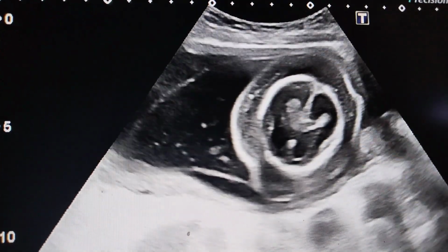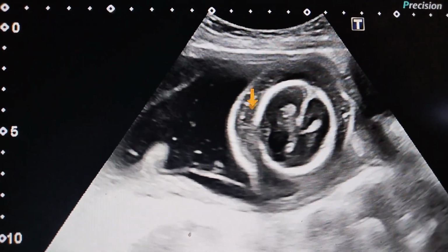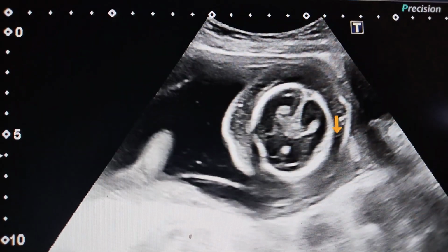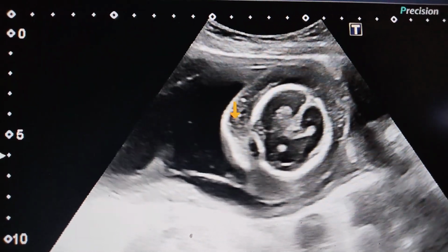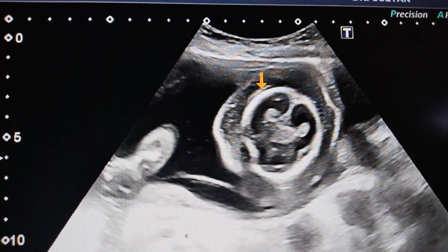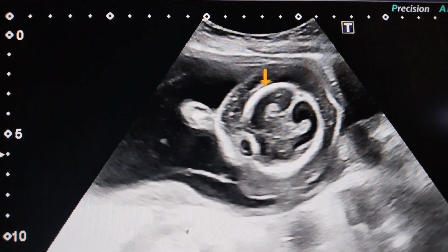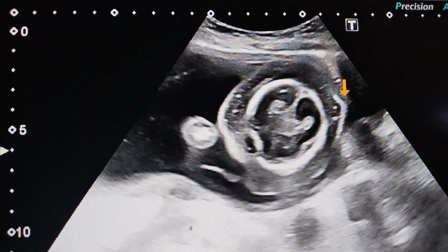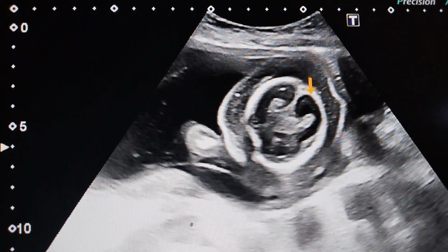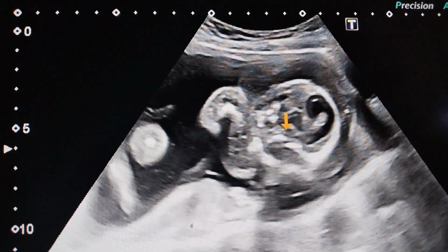Here we can appreciate this is the fetal skull, and it is surrounded by this hypoechoic area, that is the subcutaneous edema. So scalp subcutaneous edema is present. This echogenic line is the skin. These are the bones, and this is the fetal brain.